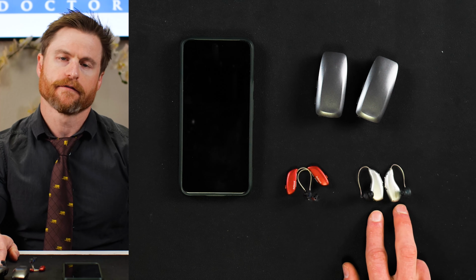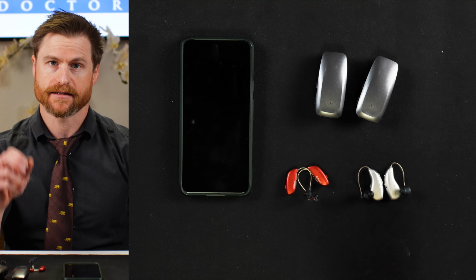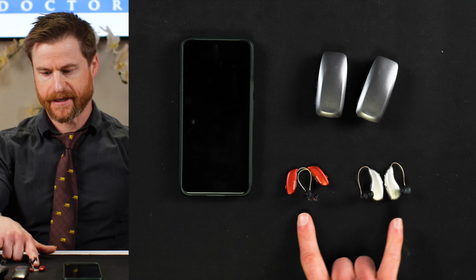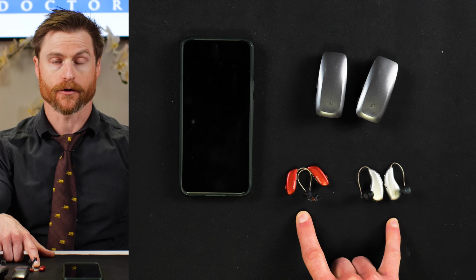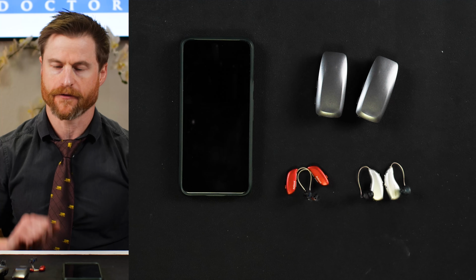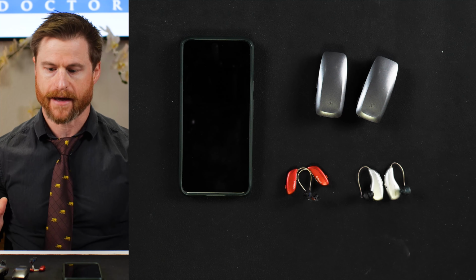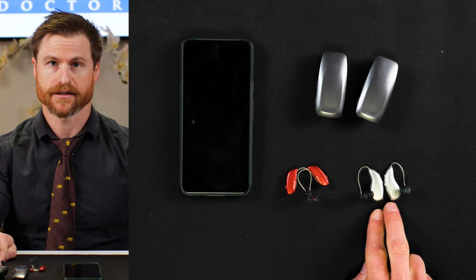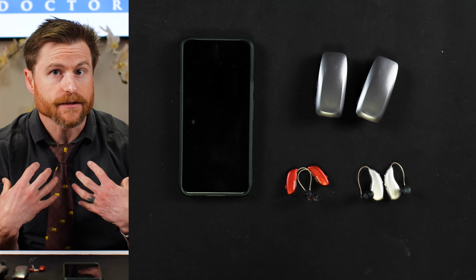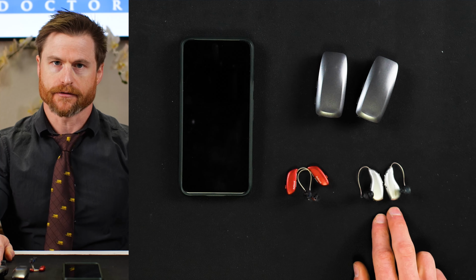Another thing that the Phonak Infinio Sphere devices do really well, in my opinion, is speech processing or speech audibility when there's background noise. I took both of these devices to a recent conference. Of course, there's certain people that will prefer one versus the other, but for me, I preferred the Phonak Sphere. I thought these did a better job boosting the speech and taking down the background noise using the artificial intelligence Sphere chip that they have inside here. ReSound did a great job too, but with my experience, it did not do as good as the Phonak. So that's another thing Phonak does really well.